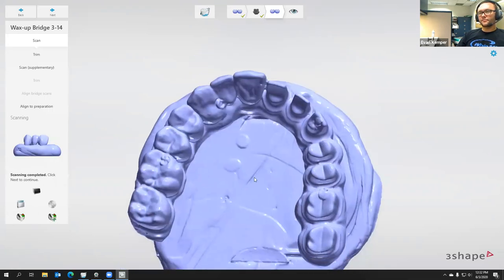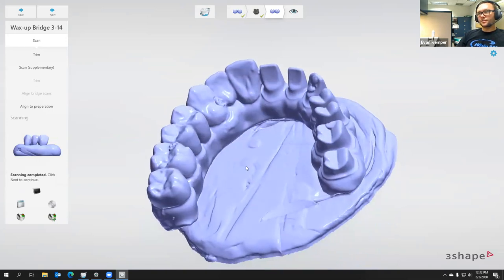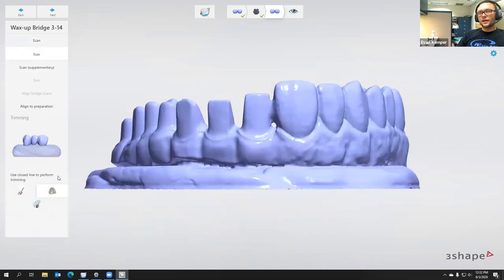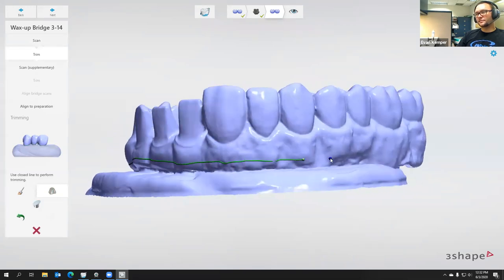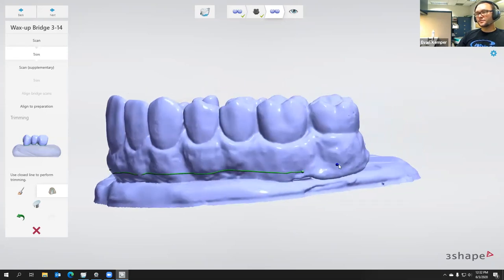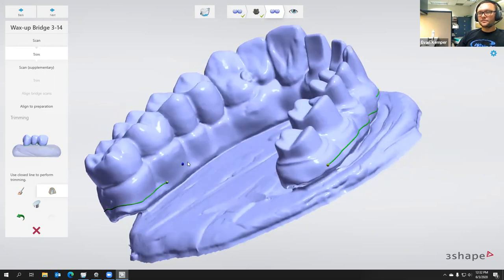So now we're going to examine it, make sure everything on the occlusal side is nice and detailed the way we want it. That looks good, so then we're going to trim it. I like to use the line mode on this just because I feel like it gives me a little bit more control on placement. And so I'm just going to go almost all the way to the blue tack, but avoid anywhere where I think that the scanner has made approximations or closed holes. So nothing on the underside. We're going to get that in the next scan.